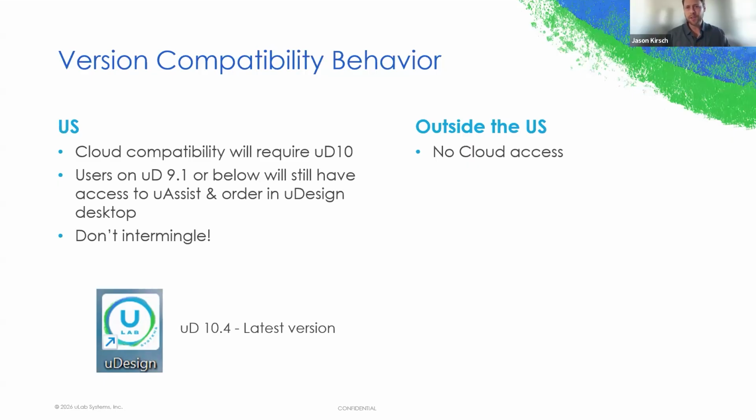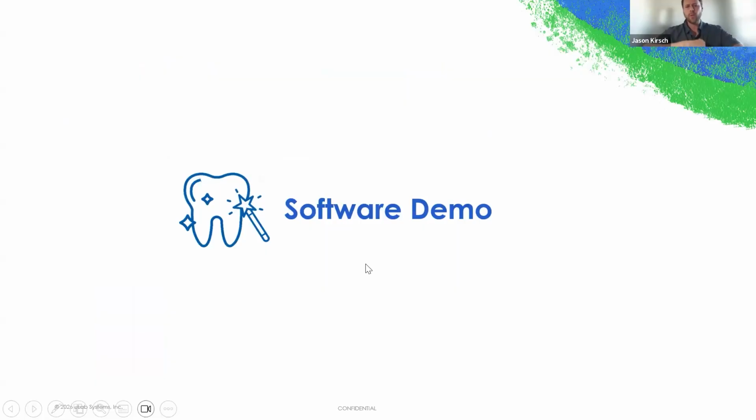If you are outside of the US, unfortunately, you do not have access to the cloud, so I apologize about that. Before I jump into the software here, if you do have any questions, you can reach out in the chat box there. We'll go through just our software overview here, and if you have any questions, mention them in the chat and I'll cover them here at the end.